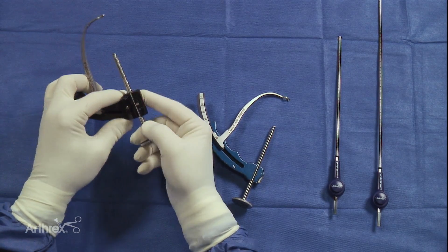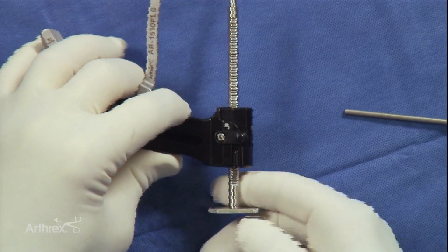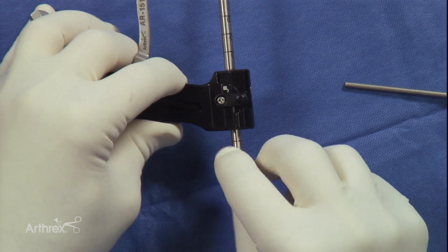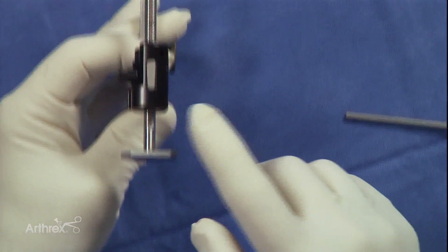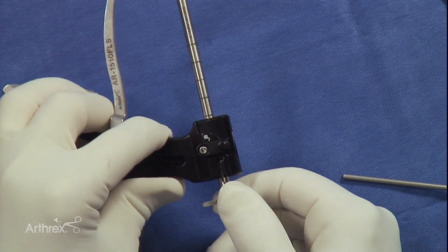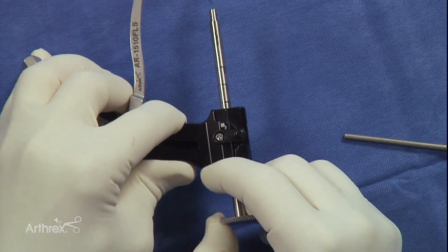I'll point out a second feature of this particular guide which is also relevant. We see the ratcheting mechanism here on the guide sheath. This is in the unlocked position, so it's freely mobile within the housing. If we rotate it such that this flat surface is in this position facing this little portion of the housing, it is now locked and I can't back it out in that position. If I want to free it up, I can then rotate it in any direction other than the one facing this portion of the housing and slide it back.